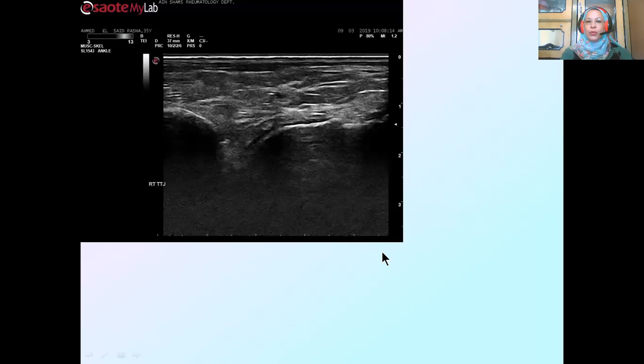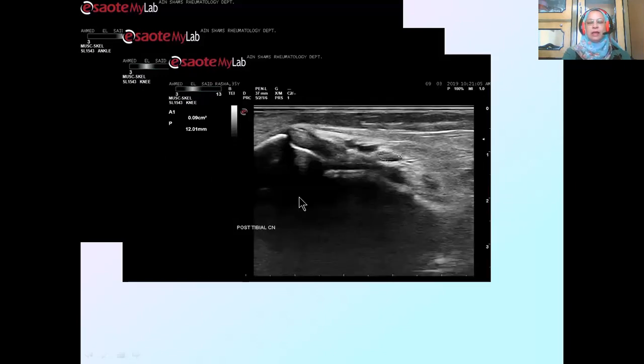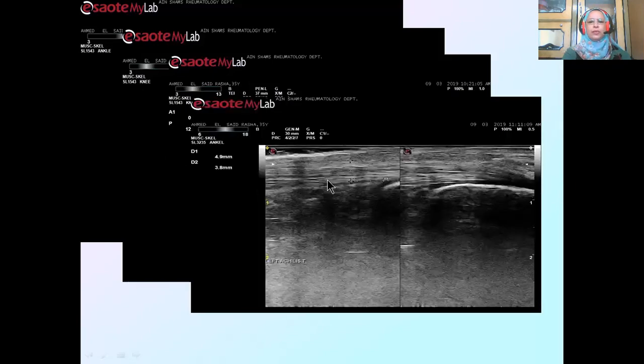Now we return to our female patient who complained of lateral ankle pain and mild swelling. She was referred for complete musculoskeletal examination of her ankle, starting with the right tibiotalar joint. There was normal finding, subtalar joint completely normal. The medial part of the ankle joint, or structures at the medial part of ankle joint, completely normal findings. Also normal Achilles tendon and normal plantar fascia.